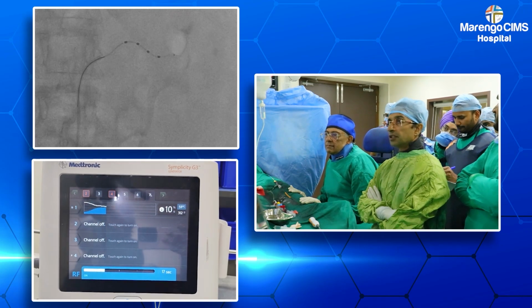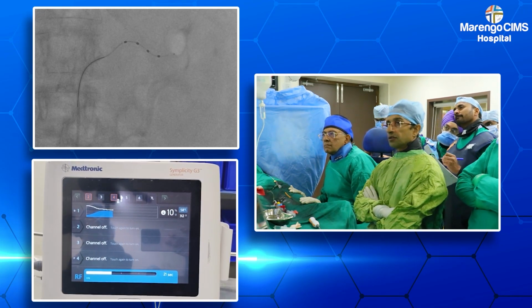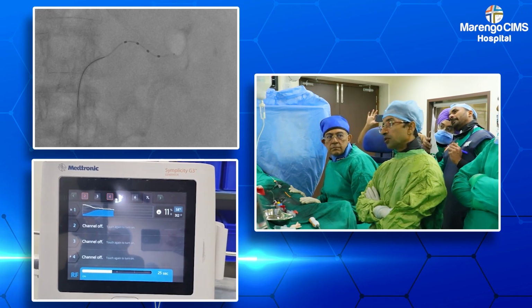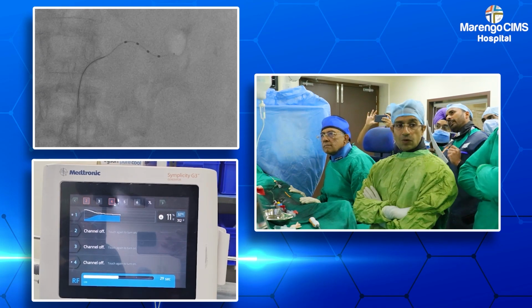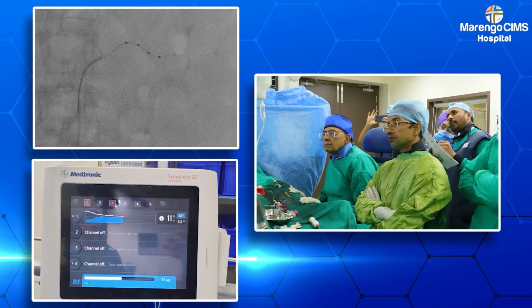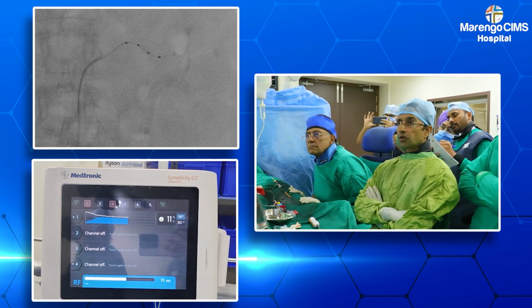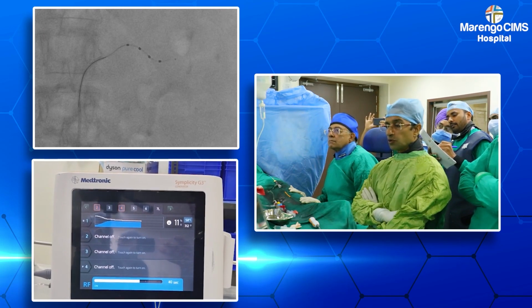So as you can see now on the screen, the ablation has started. Temperature rising to about 60 and impedance falling by about 10-11%. The wire is in the guiding catheter. The checklists have to be ensured. The electrode is well positioned, good contact, and the ablation is going on smoothly.